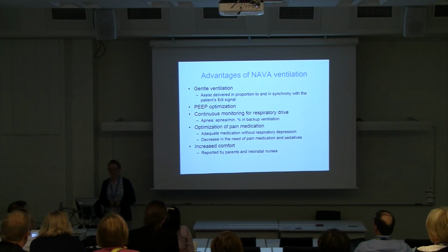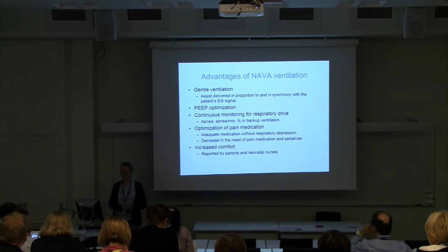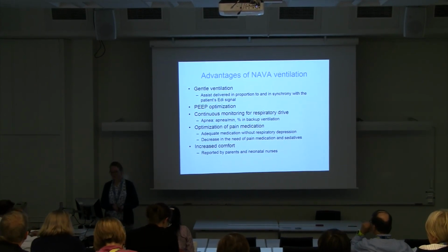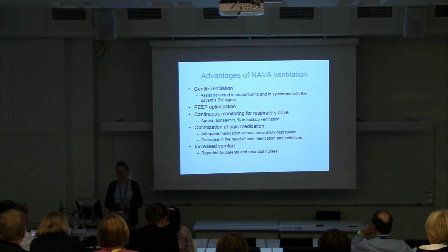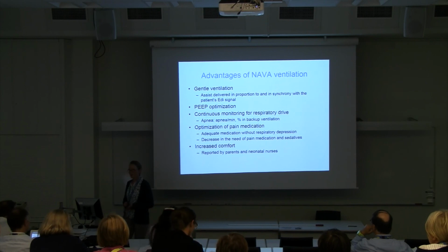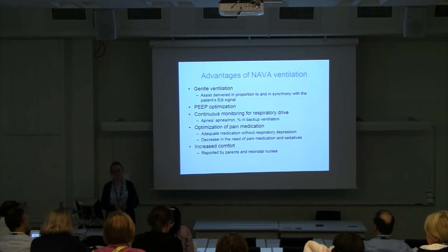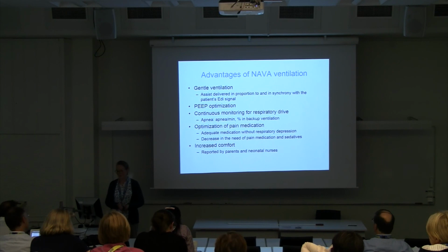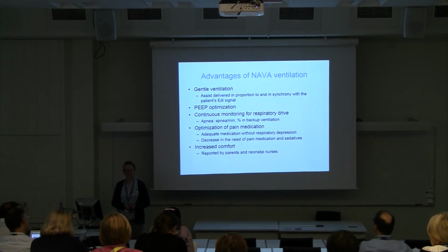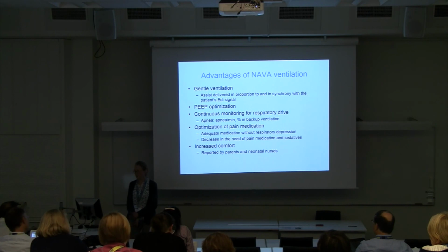So I would like to conclude about the advantages of NAVA ventilation. It is gentle because the assist is delivered in proportion to and in synchrony with the patient's EDI signal. For the first time, we really can optimize the PEEP with the help of the EDI minimum value. We can continuously monitor the respiratory drive for the patient, how many apnea per minute, and the percentage of time the patient is on backup ventilation.